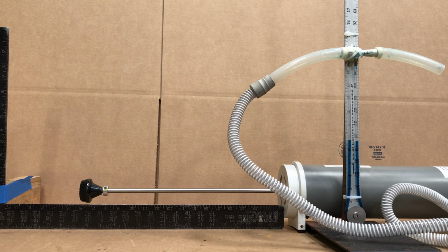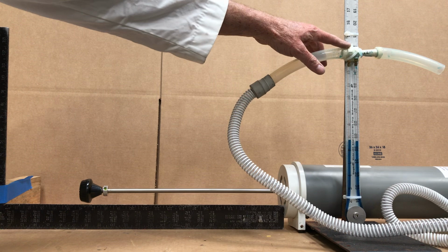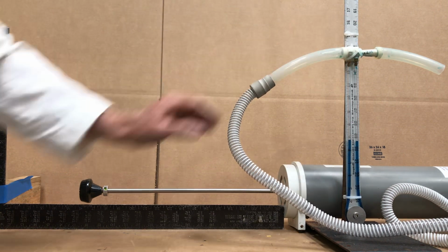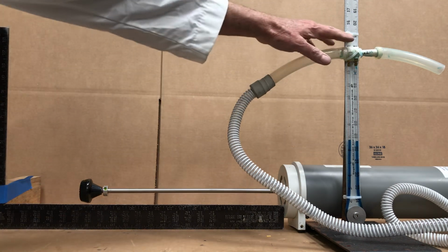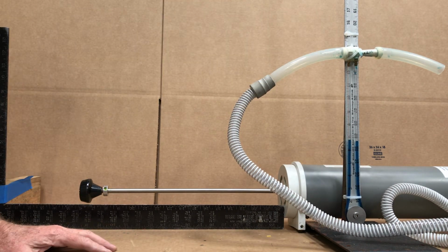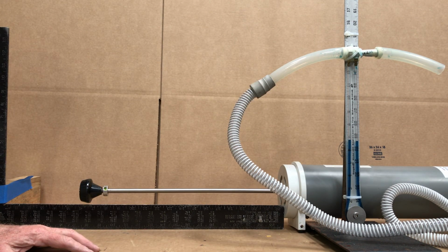Here's a little project for all you bored computer scientists out there under quarantine. So we have a 3-liter syringe right here. We have a Venturi right here with a throat of 0.259 inches. And what we'd like to do is measure the volume flow rate of a patient hooked to a ventilator with this type of flowmeter that can be 3D printed.